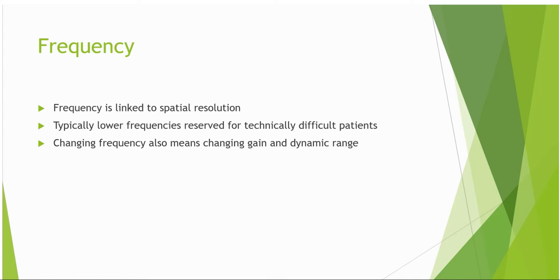By adjusting the frequency, it is very much necessary then to adjust the gain and dynamic range settings, as it is highly unlikely that these settings will be consistent through the various modes.